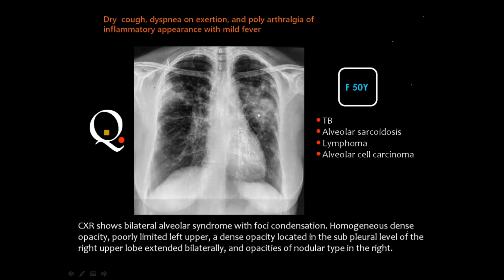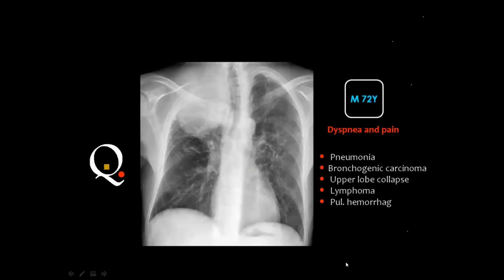This mixed appearance is for the differential diagnosis, and the diagnostic possibilities include so and so and so. I am not one of those who like recommendations in the report, and do not say recommended for CT or MRI or guided biopsy. Let the physician behave according to the data he has collected about the patient: the clinical data, the lab data, and the radiological data as well.